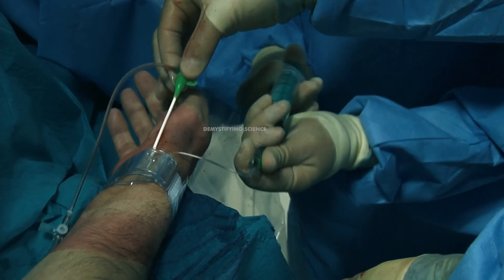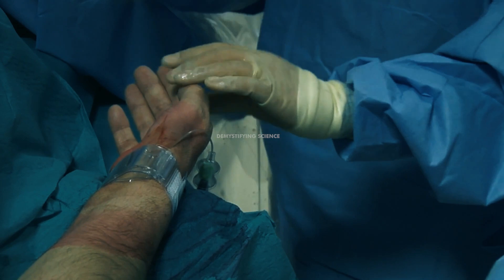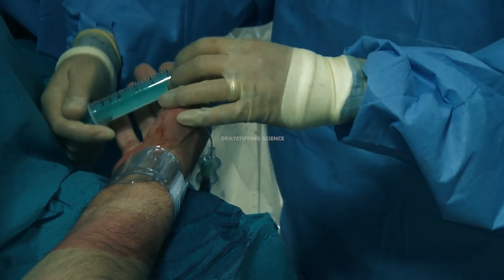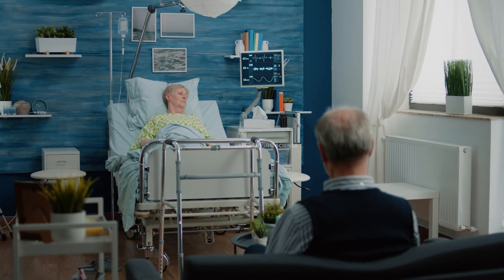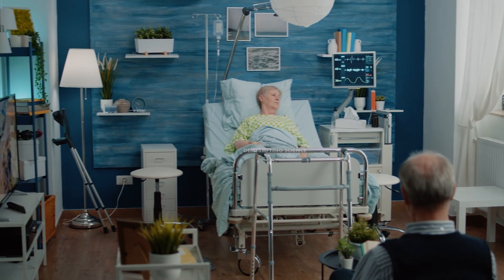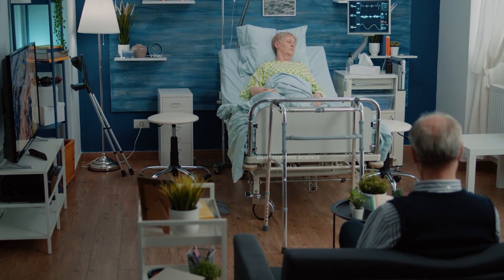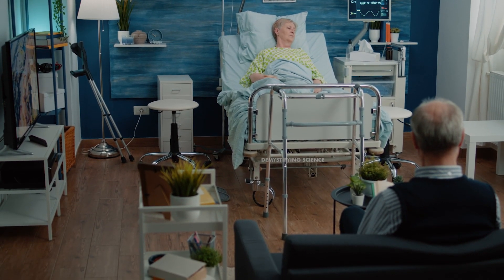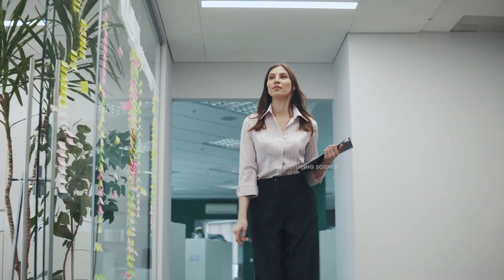When the angioplasty is completed, the cardiologist removes the catheters and bandages. Typically, a person will recover in the hospital for a few hours or overnight before going home. People can often return to work within a week, but their doctor will advise on how active they can be and when.